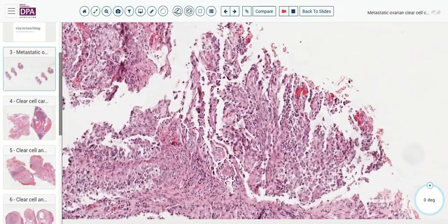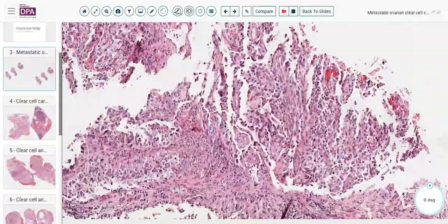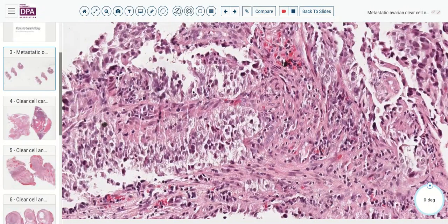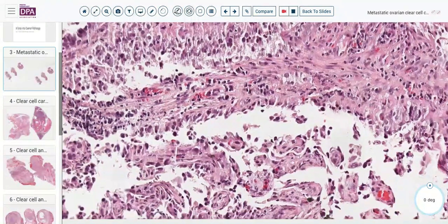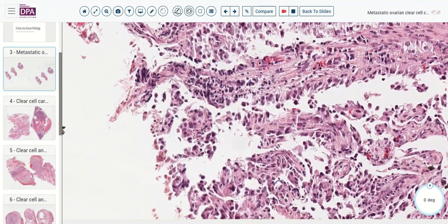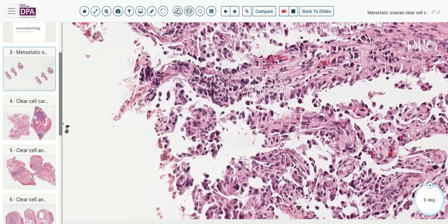Here's another area where we can again see these clear cells. You can begin to see that the nuclei tend to move up towards the apex of the cytoplasm — a little more pleomorphism and this apical location of the nuclei, which is characteristic of ovarian and endometrial clear cell tumors.